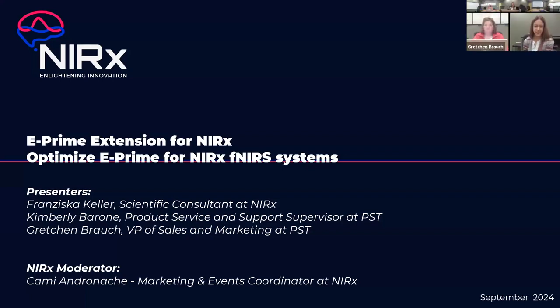Perfect. All right, everyone, thank you so much again for joining here today for yet another NIRx webinar. Today we want to talk about the wonderful E Prime extension for NIRx, which is a new product that we have developed in collaboration with our colleagues at Psychology Software Tools, or PST, who are also joining me here today. I'm also joined by our wonderful event and marketing coordinator, Cami, who is working in the background to ensure that everything is working smoothly.